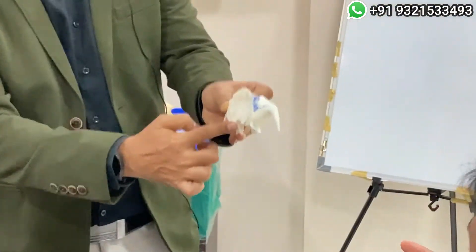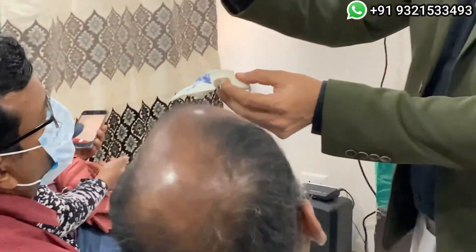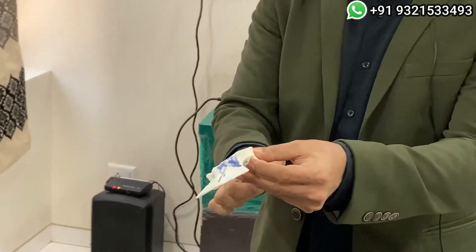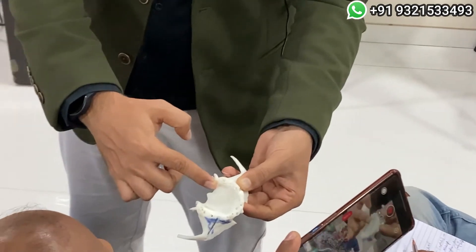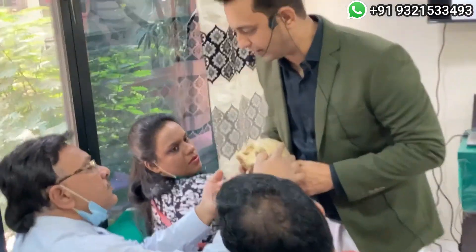I'll show you: if I palpate like this, can I palpate the hamula process? I have palpated, but is my finger adapted on the ridge? No. Now my finger is adapted on the ridge. Right now I have palpated but my finger is not on the ridge — but now my finger is adapted on the ridge. The patient will be in front of you and you palpate. You are a right-hand operator.